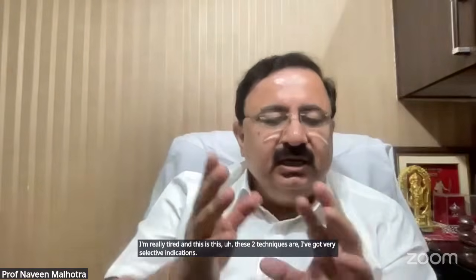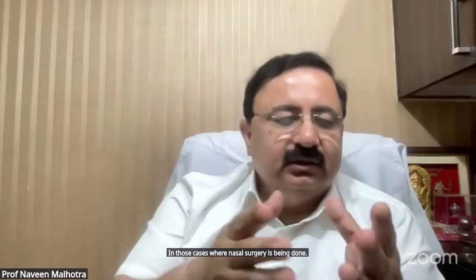In case of large thyroid, it may be helpful, sir, as tracheotomy is also difficult. I don't think it's relevant to this topic. No, thyroid is not relevant. These two techniques have very selective indications in patients with panfacial trauma, where orotracheal intubation is not possible because you are going to do a maxillary mandibular fixation, and nasotracheal intubation is contraindicated in those cases where nasal surgery is being done. Then, to avoid perioperative tracheostomy, you do either retromolar intubation or submento-tracheal intubation.